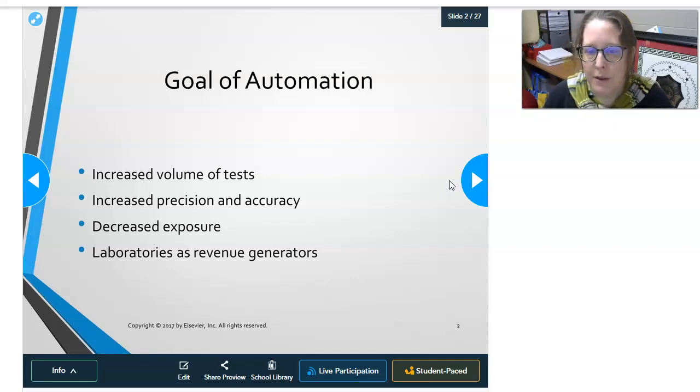So obviously we first applied automation to the analytical process, and that's how we came out with all the different analyzers that you can find in the laboratory. And then it started moving to the pre-analytical phase because that still ended up being a big source of error. There's still a human factor because you still need a human to draw blood specimens from the patients. But really, specimen processing and all of that can be automated, and that also allowed for a reduction in errors.